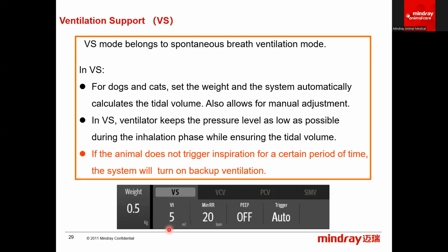So what VS does is, when your patient takes a spontaneous breath, the ventilator is going to apply as low a supplemental airway pressure as possible during that inhalation phase to try to reach this goal tidal volume, this set tidal volume. With every breath that the patient takes, the ventilator will automatically recalculate and reevaluate what our tidal volume looked like on this last breath. Okay, let's go up by 1 centimeter of water for the next breath, and see if we reach our goal tidal volume on this next one.